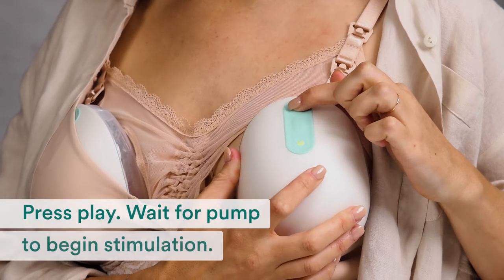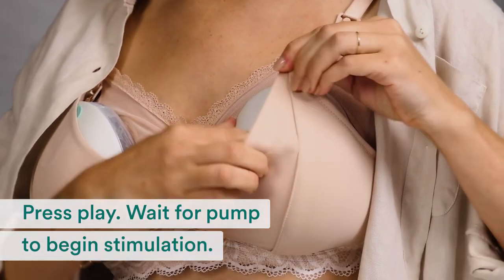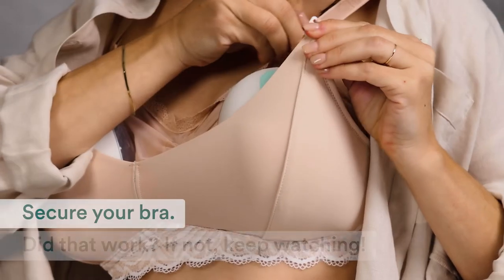Press play and wait for your pump to begin the stimulation phase. Then secure your bra.